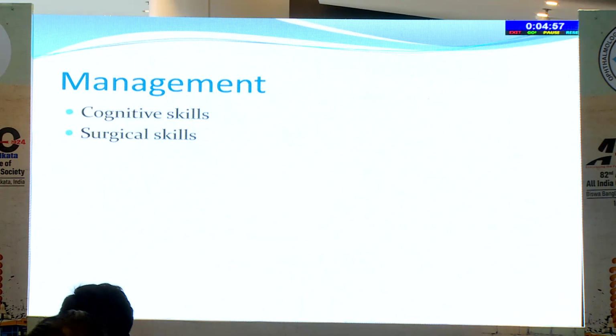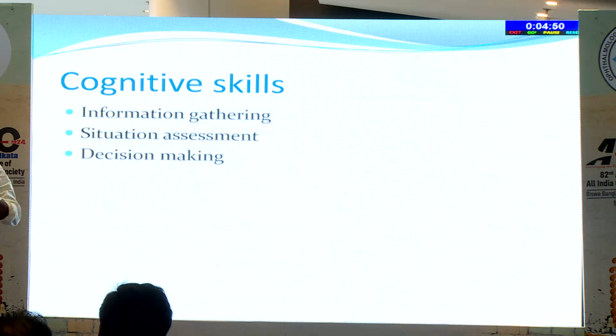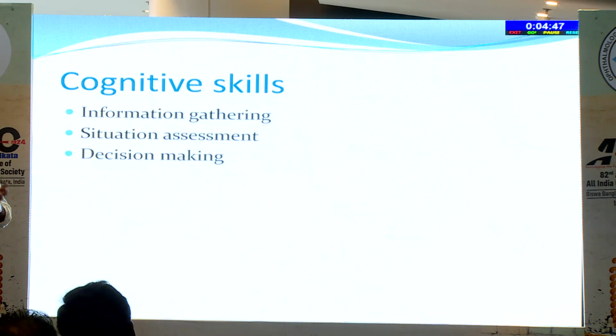When you have to manage this case, you have to have cognitive skills and surgical skills. Both are very important. So always take a breath. Never pull out of the anterior chamber. That's one big thing. Whenever you suspect a rent, always keep the phaco probe there, going through the side port. Use something like Viscoat, no financial interest. Try to block and make the rest of the pieces stable so that we can handle it later in a better way. And then when you are out, stop for a while, think about what happened, look at the situation.